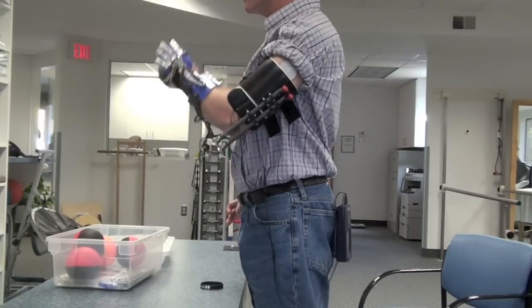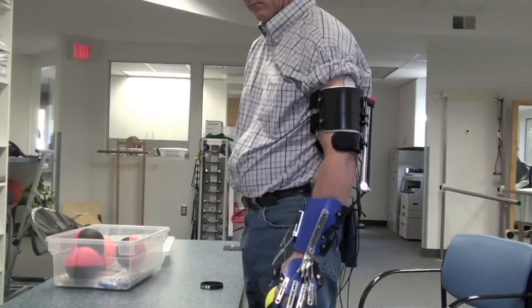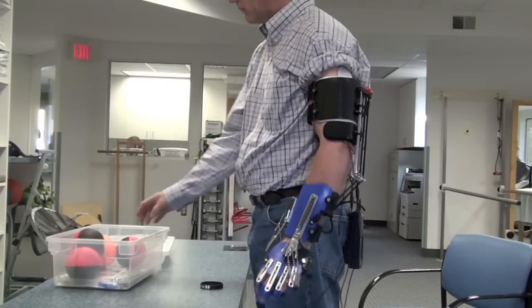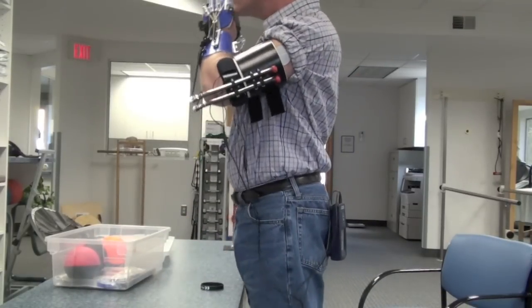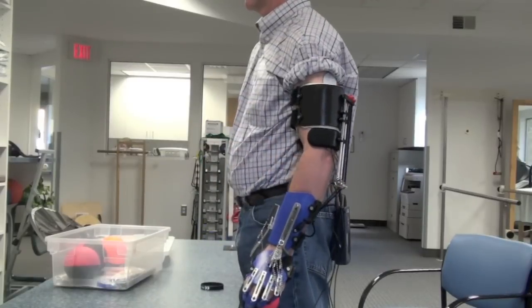See here — the patient is going to grasp the ball off the table and bring it to his mouth, activating his biceps, which exceeds the activation threshold. Then he'll relax his biceps to fall below the deactivation threshold and receive stimulation to the triceps.